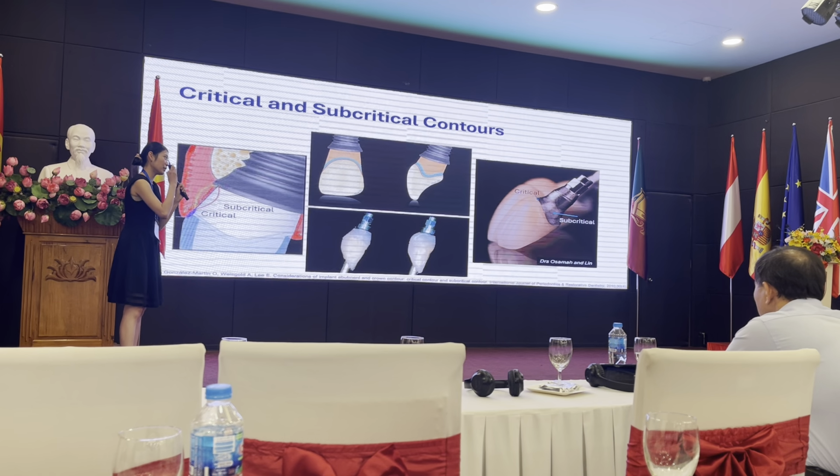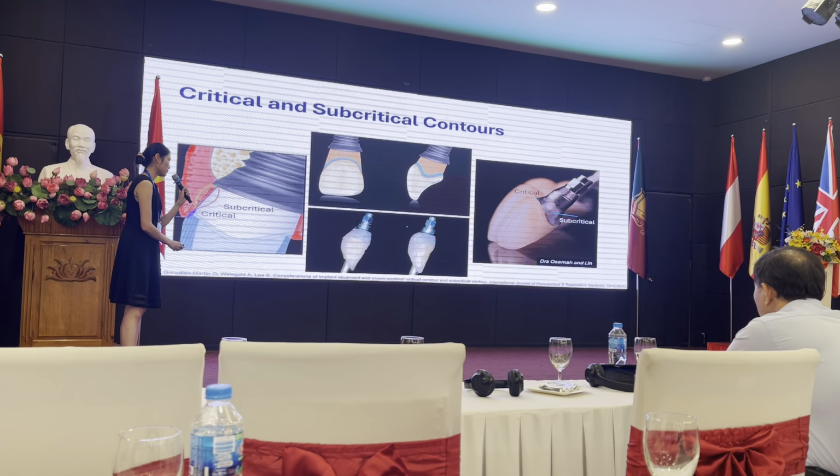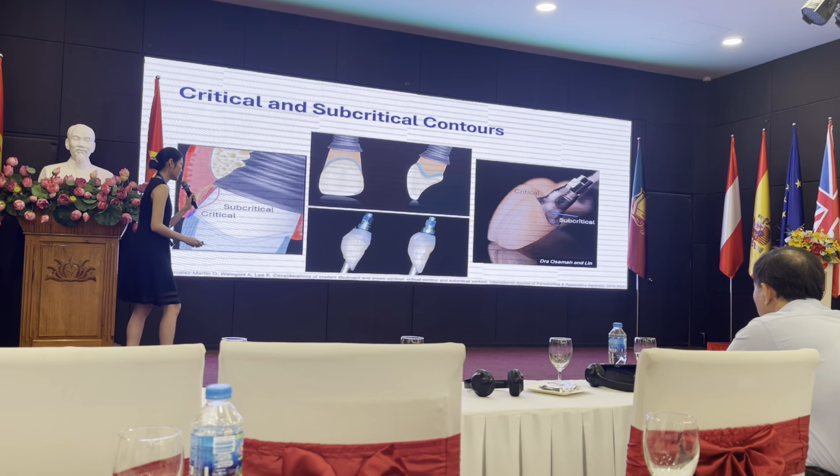Keep your soft tissue. You don't want to compress it too much.